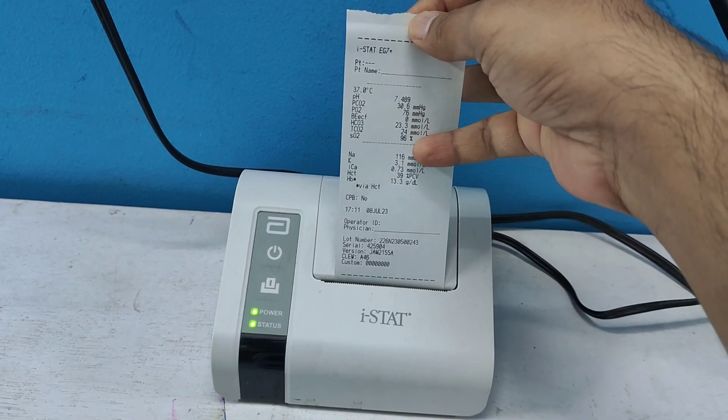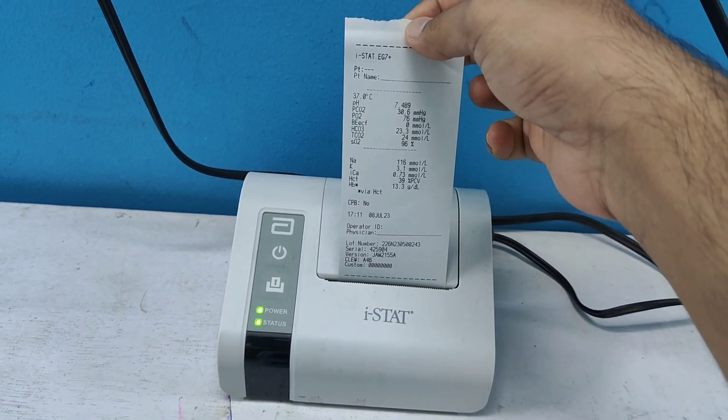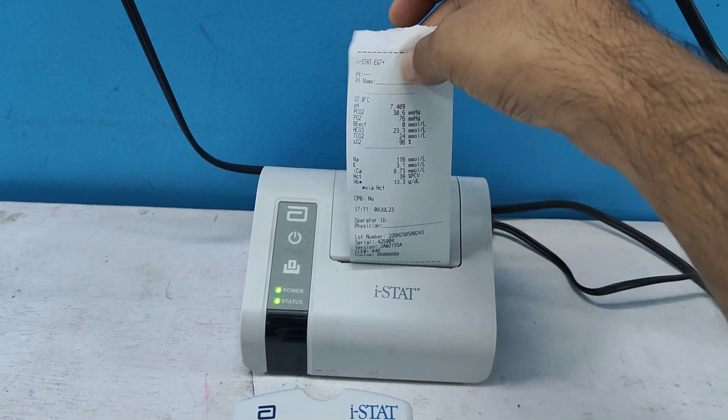The printout also gives sodium, potassium, ionized calcium, hematocrit value, and hemoglobin. Since I did not enter the patient's name or ID, that section is blank.